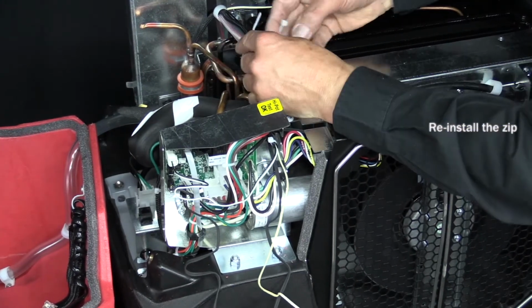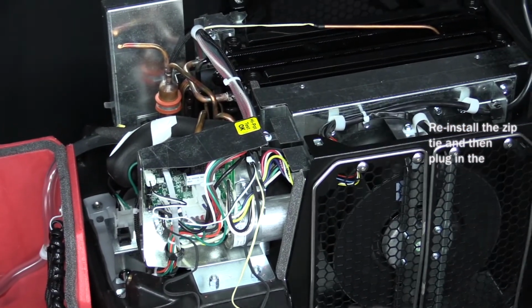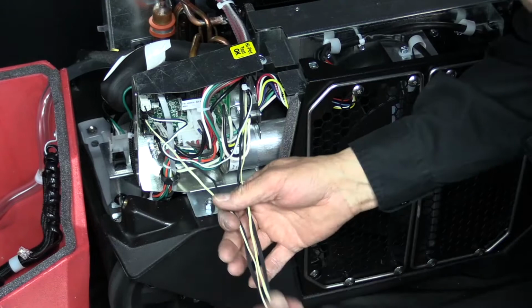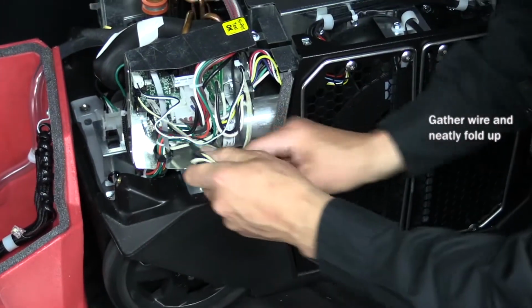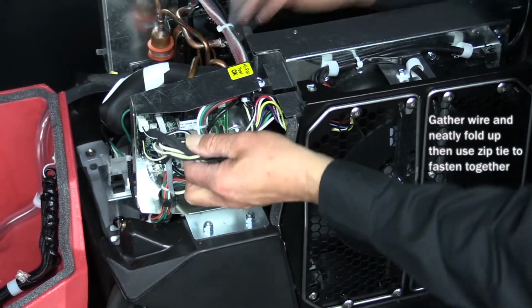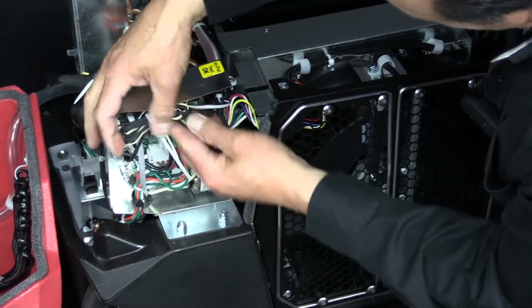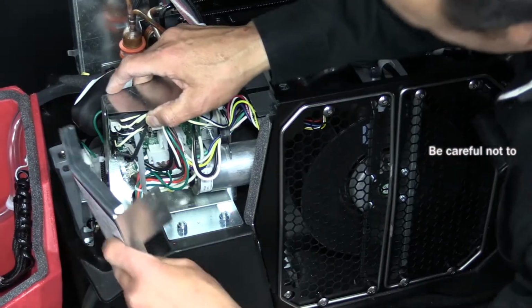And then reinstall the zip tie around the harness. And then remove the excess. Next, we'll take the end of the thermistor probe and plug it into the control box. And then we'll gather the wire. And then we'll neatly fold it up. And then we'll fasten it all together with another zip tie. And again, we'll cut off the excess and then reinstall the control box cover.